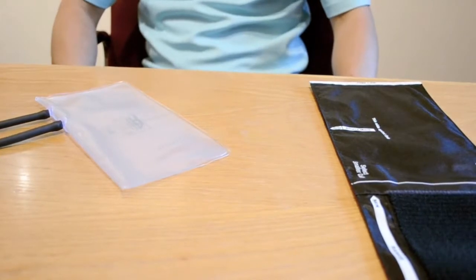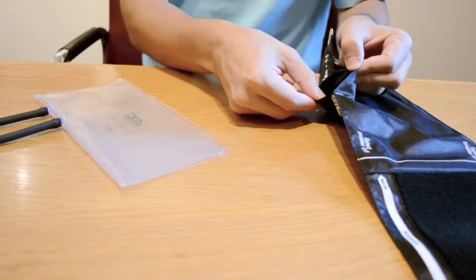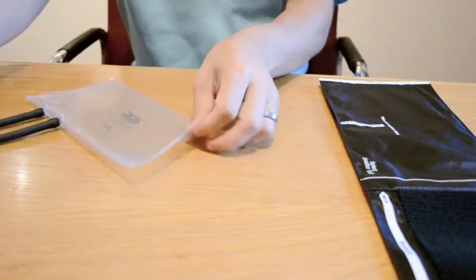To begin, place the cuff on a flat surface face down with the range markings on the left-hand side. Locate the opening on the top right-hand side of the cuff. It is here where you insert the bladder.